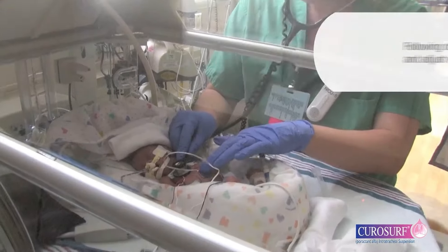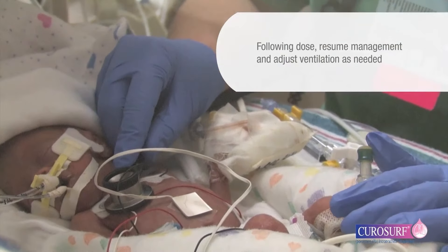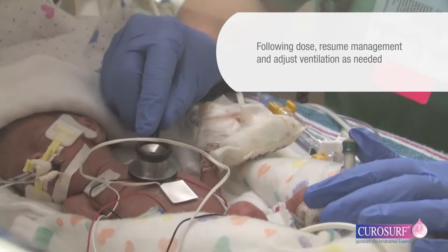After completion of the dosing procedure, resume usual ventilator management, monitoring and adjusting ventilator settings as needed.